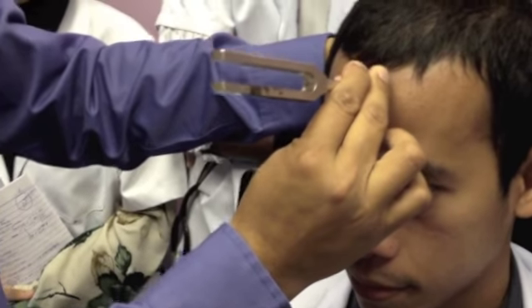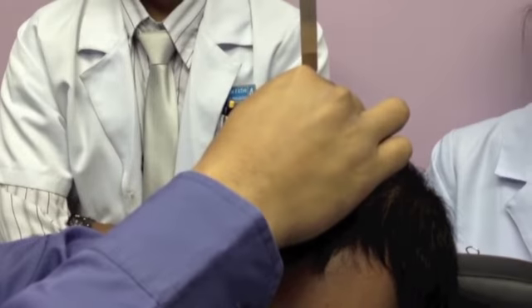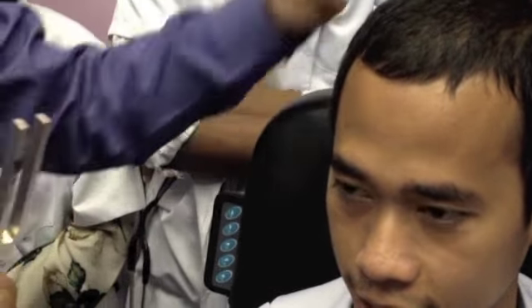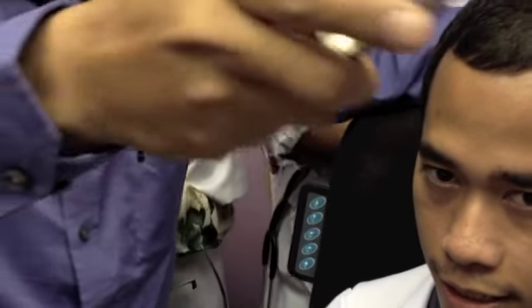Alright. Bunyi sebelah mana? Tak bunyi. It's okay. It's equal. Tak bunyi tak apa. It's equal. But if the patient tends to hear from this side, then you have a pathology. Understand? Now, where did I stop? Here.